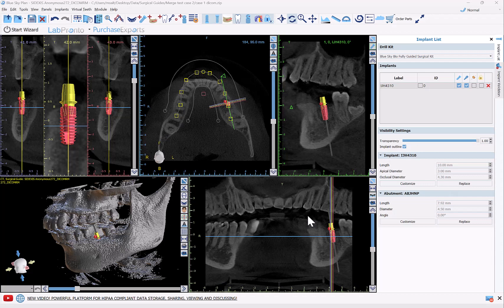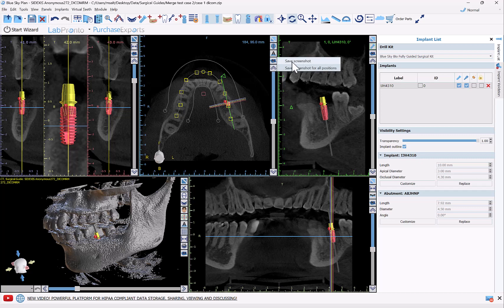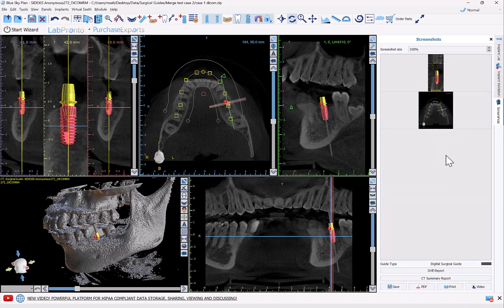Some possibly lesser-known Blue Sky Plan functionality is that next to every view you have a camera. If you click on the camera it will take a screenshot. You have an option of save screenshot or save screenshot for all positions — all positions will go through each slice and save that screenshot. Save screenshot puts the screenshot into a basket of screenshots.